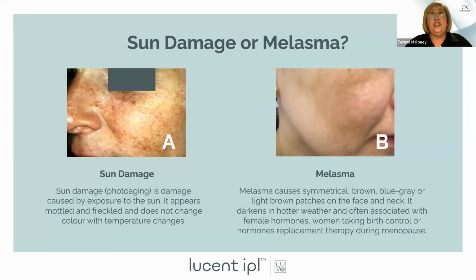515, I would use in toning mode on Asian skin types. I've seen it being done, and with really excellent results. I don't think I would use it as my sledgehammer if I'm using it on a skin type 4, and absolutely safe to use on a skin type 3.